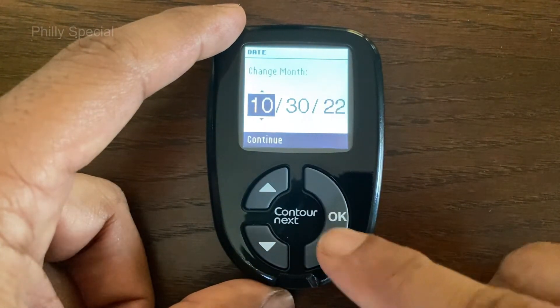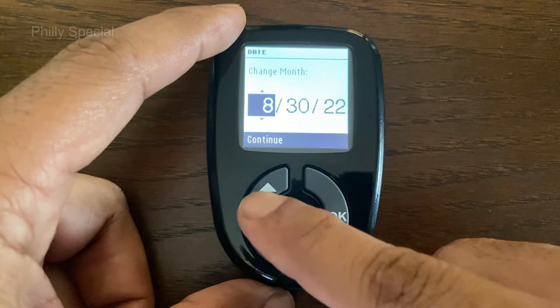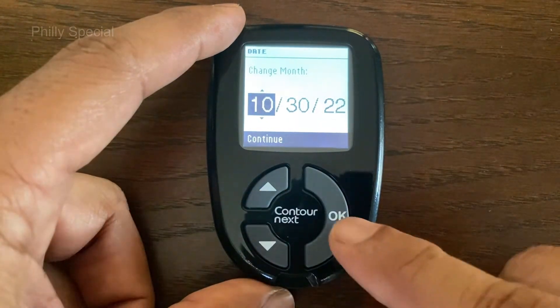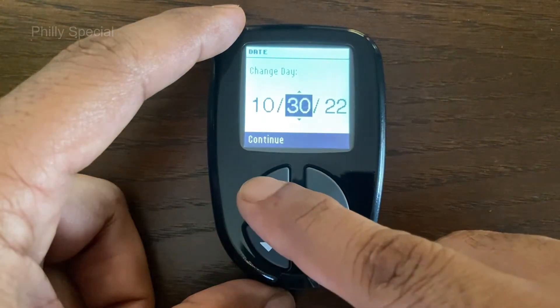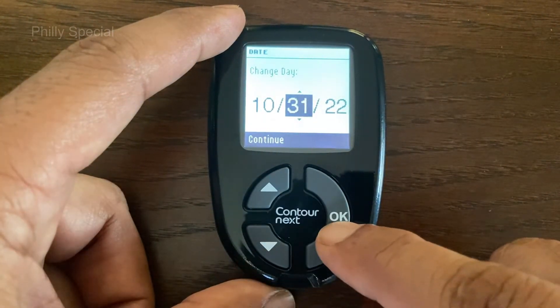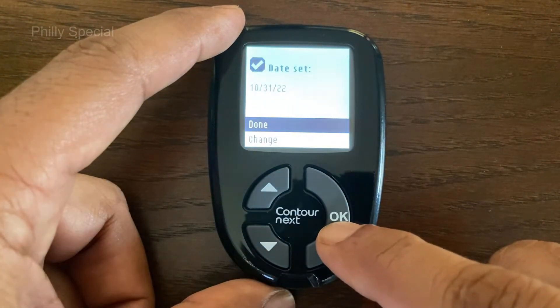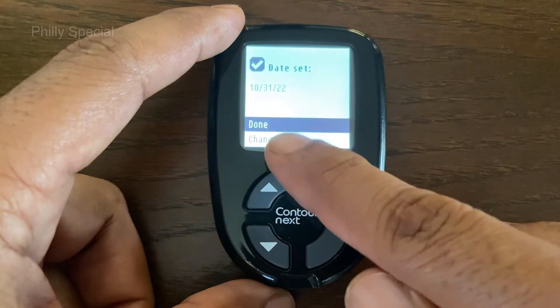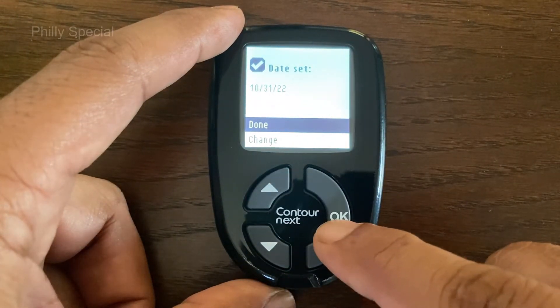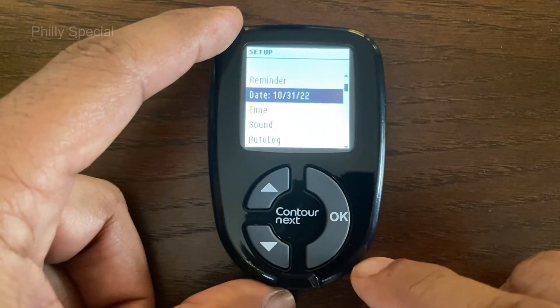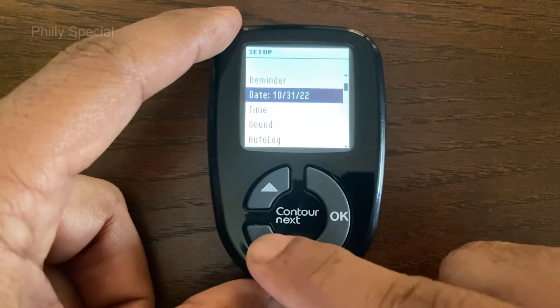In a similar way, change the month and day. Next, the screen confirms your date setting. Done will be highlighted. Press OK to confirm.